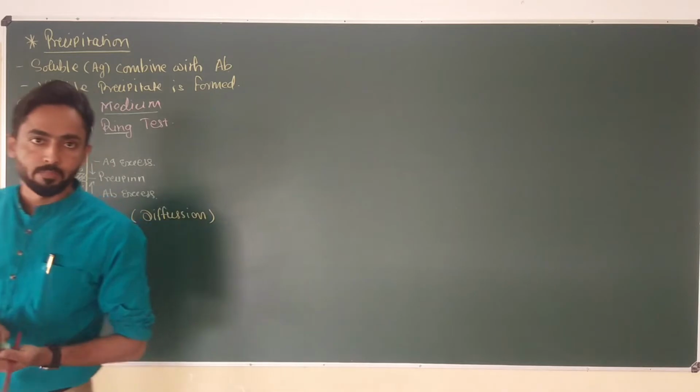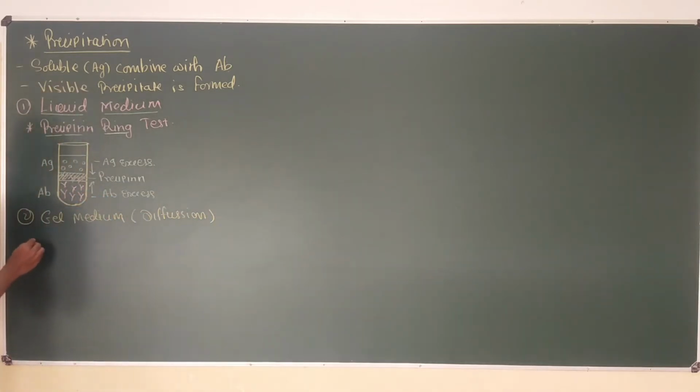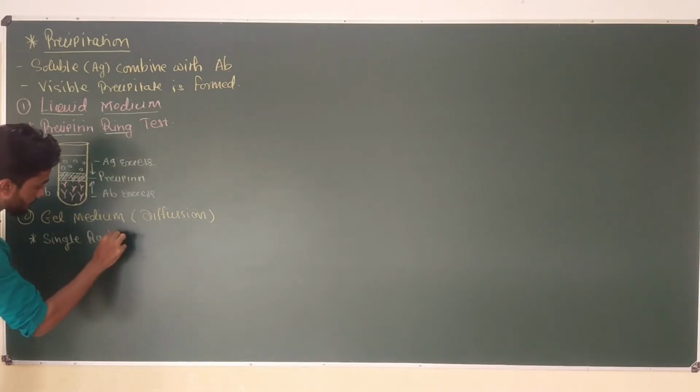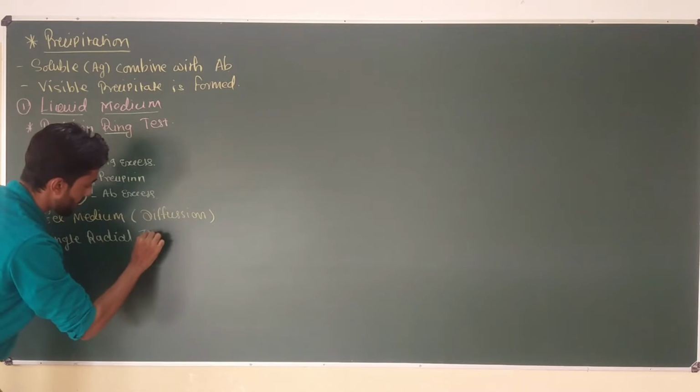And the example of this type of reaction, number one, is single radial immunodiffusion.